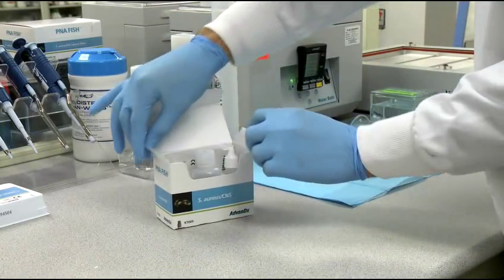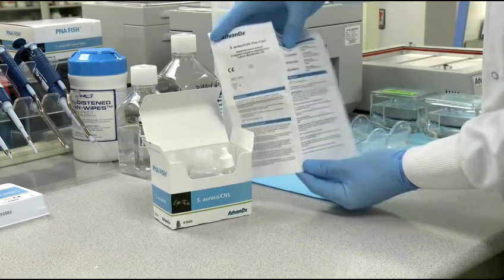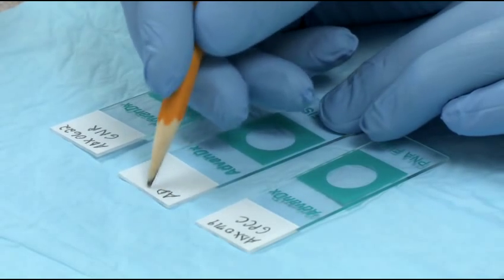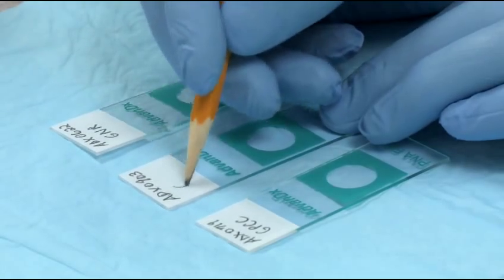Before you begin, be sure to review the package insert for complete instructions. Label slides with sample identifier and the appropriate gram stain result.